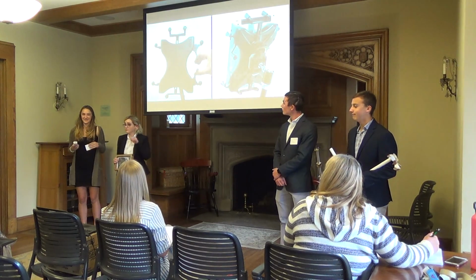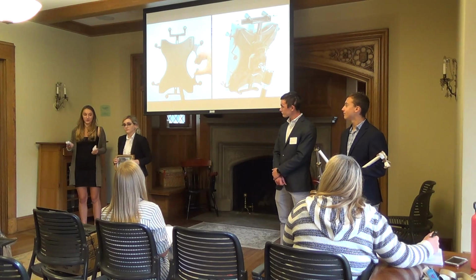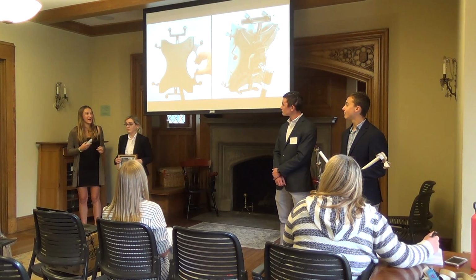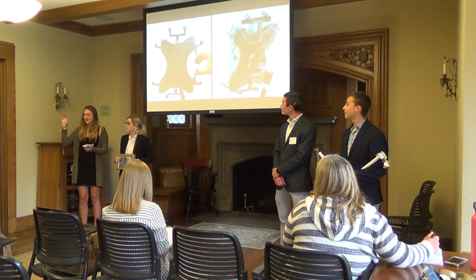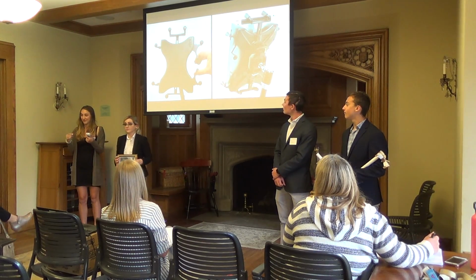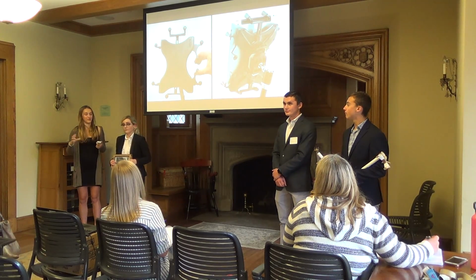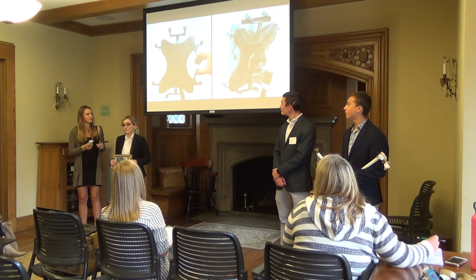Okay, now I want to direct your attention to this device. This is another device holder that we saw in use at UCP. As the image shows, it's supposed to be able to be opened with one hand. However, when we actually went to UCP and were playing around with it, we found that it took either 2 hands or sometimes even more to open it, and it was not very easy to use.